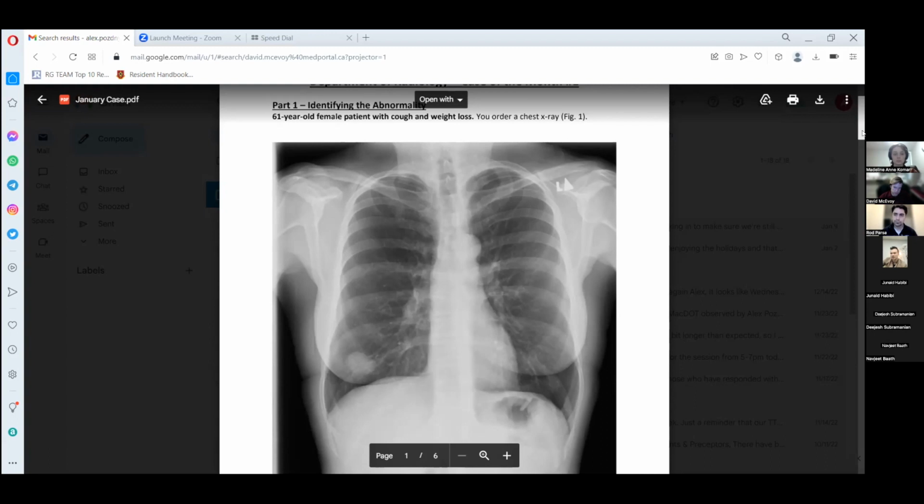Depending on the different densities of the different parts of the body, the rate of deflection of the X-ray particles will be different, and that's why you have different shades of white, gray, and black on your radiograph.